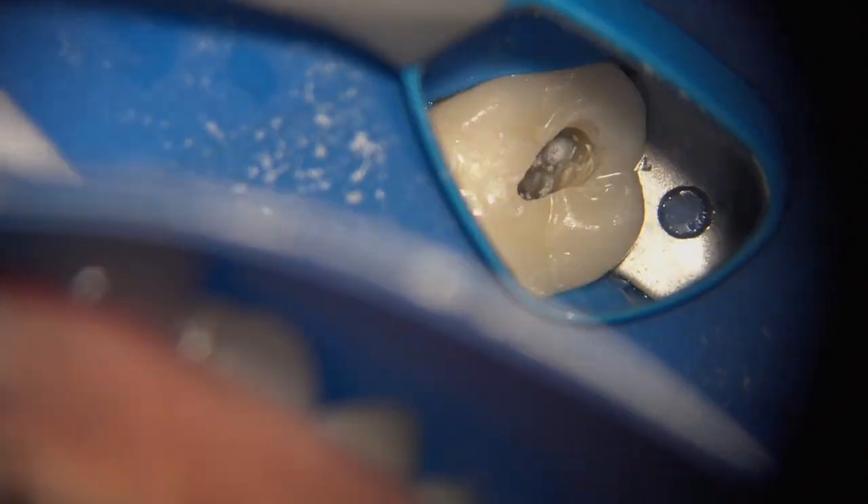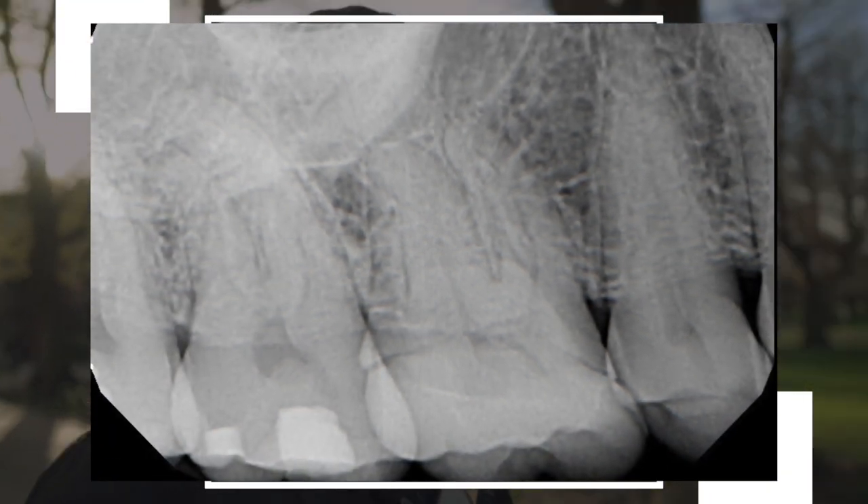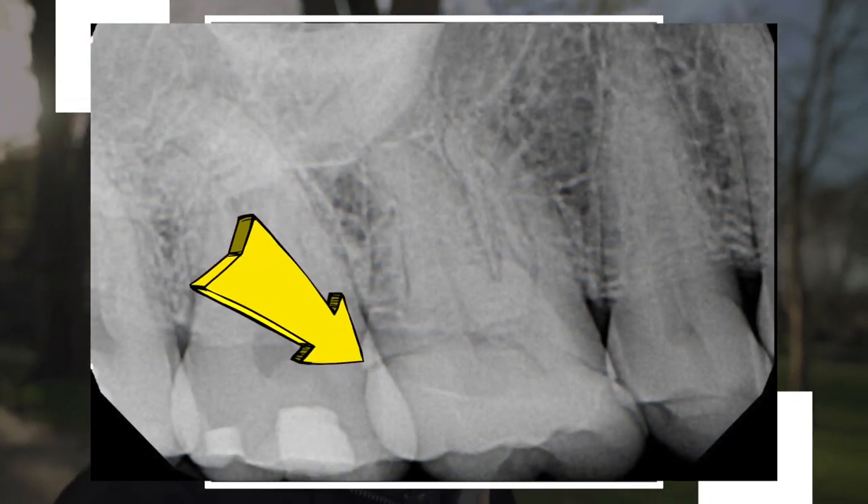Some of these crowns need to be adequately cooled, and at the same time you have to make sure your preparation is pretty slow so you don't end up potentially cracking or causing craze lines. This crown was relatively new — only a couple of years old — although the margins were not quite as well cemented, which is something to address in the follow-up.